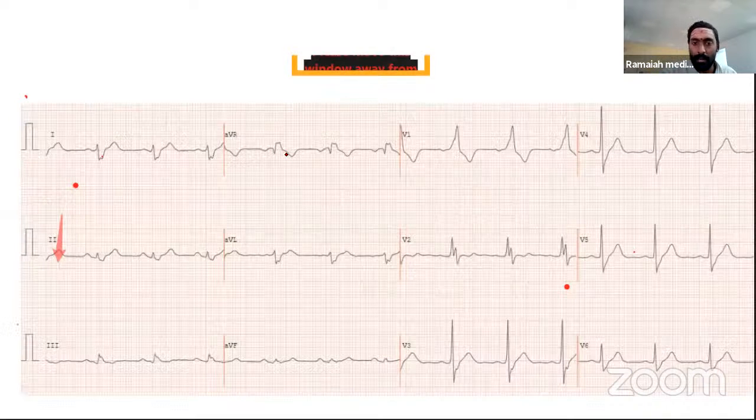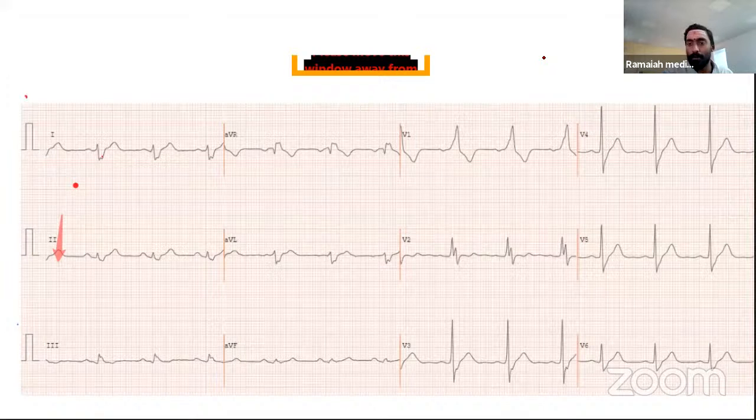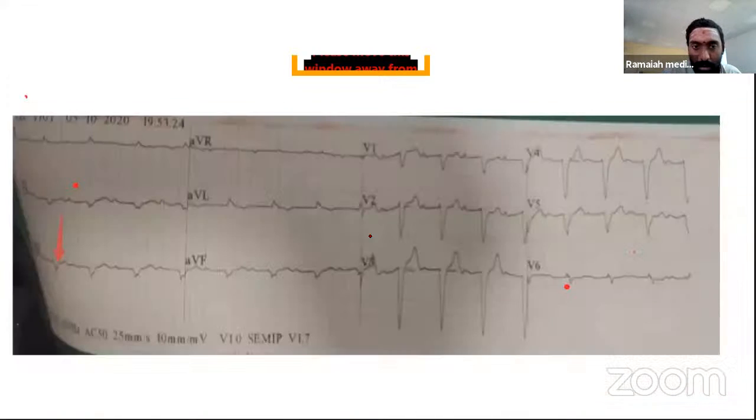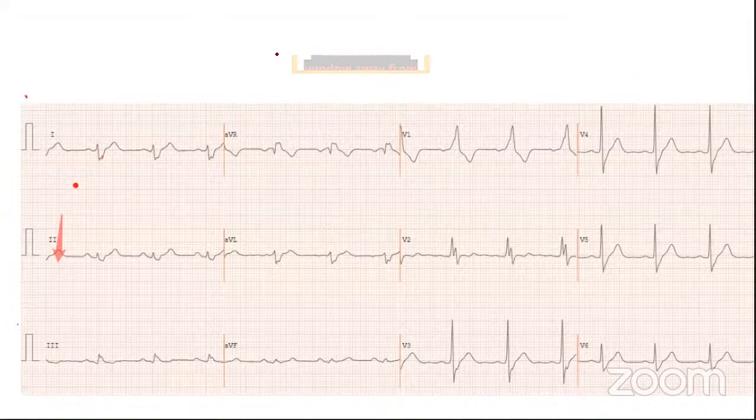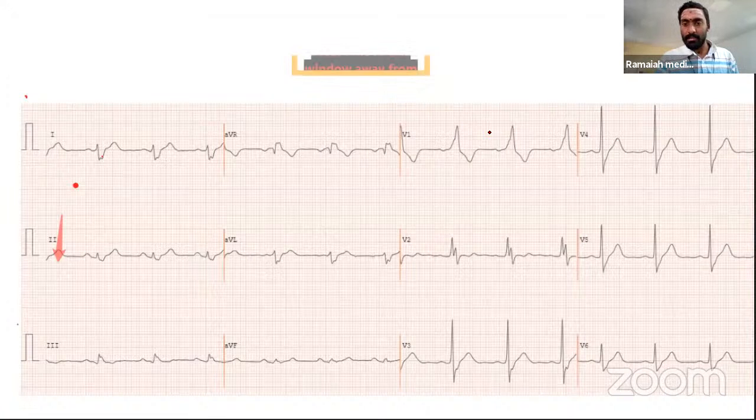Okay. Fine. So what about this ECG? I think this is there. How do you say aVR is negative here? Yeah, aVR, you have to actually zoom in and see. So this ECG, anyone taking? Poor limb lead and good voltage in the precordial leads.